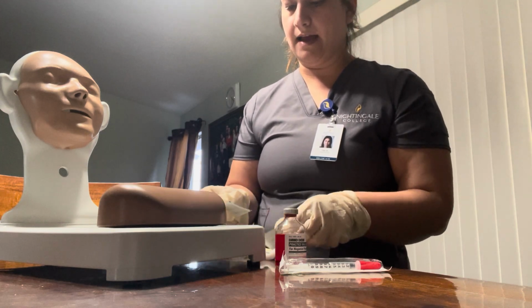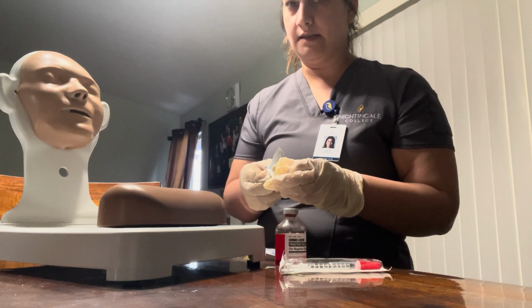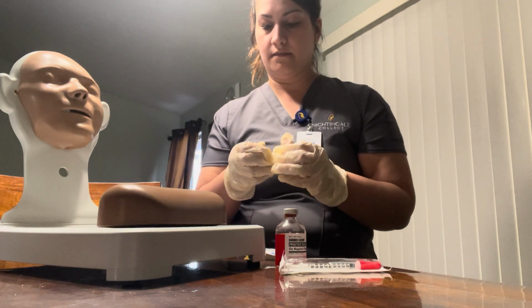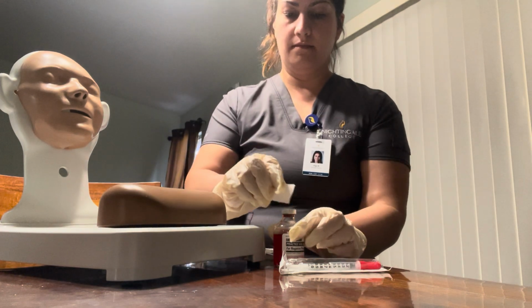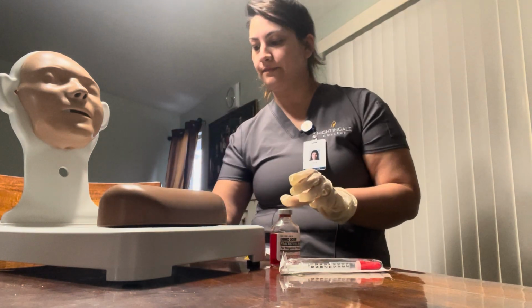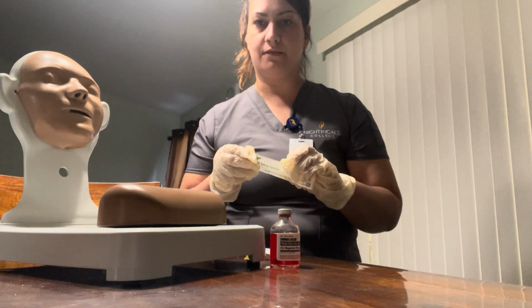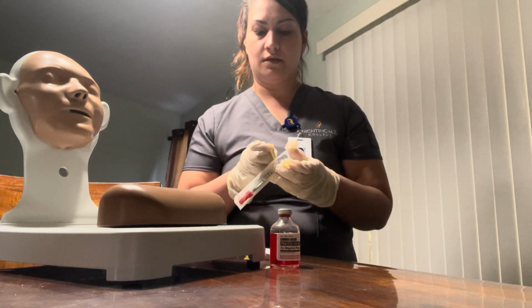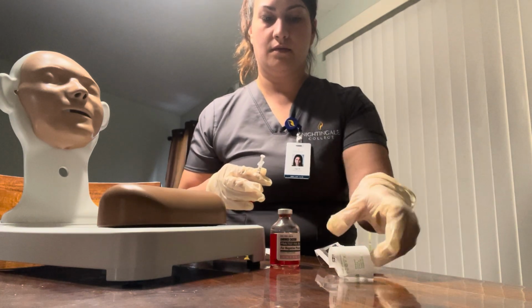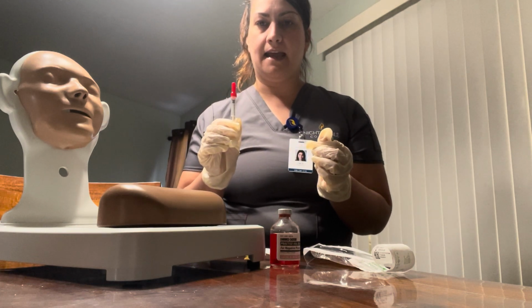And I will start by wiping the top of my container. If there's a cap, I will remove it. Wipe it, let it air dry by itself. I will discard this. All right, next I'm going to open up my syringe. And I'm gonna hold it like a pencil.